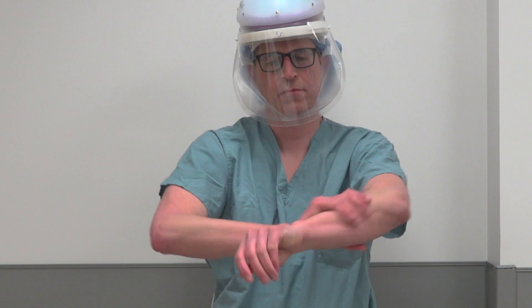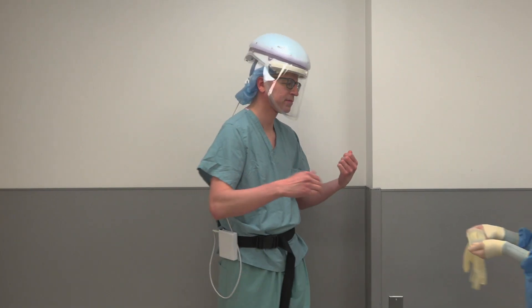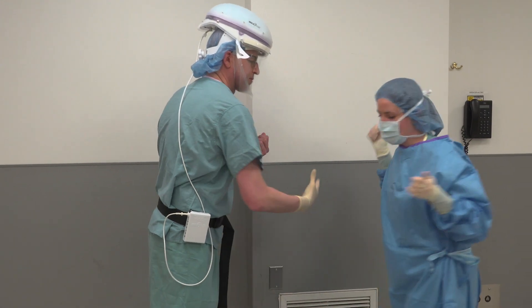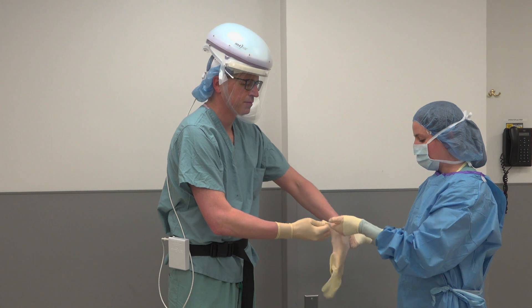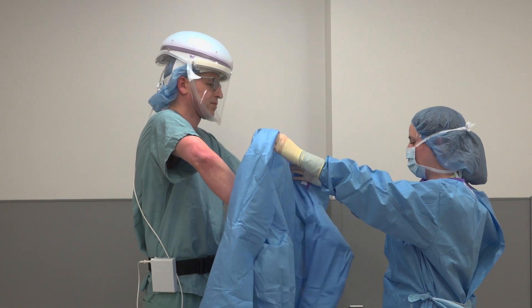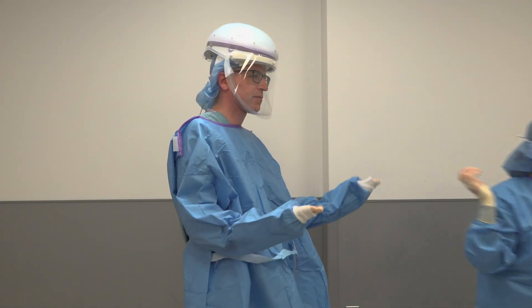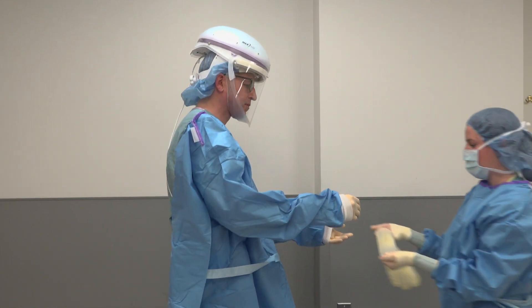Lastly, move the cable behind your back and not under your arm. Next, proceed to perform a standard scrubbing technique using either a standard alcohol-based solution or traditional scrub. First, don a pair of gloves that will go under your gown. Next, place your surgical gown either yourself or with the help of an assistant. Then place a second set of surgical gloves as standard over the gown wrists.